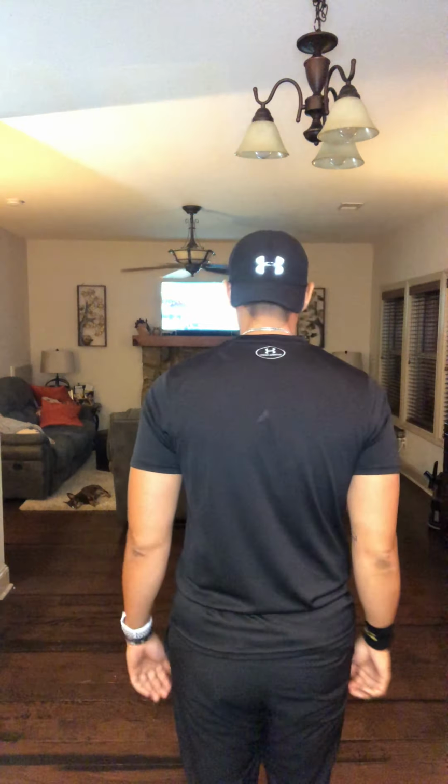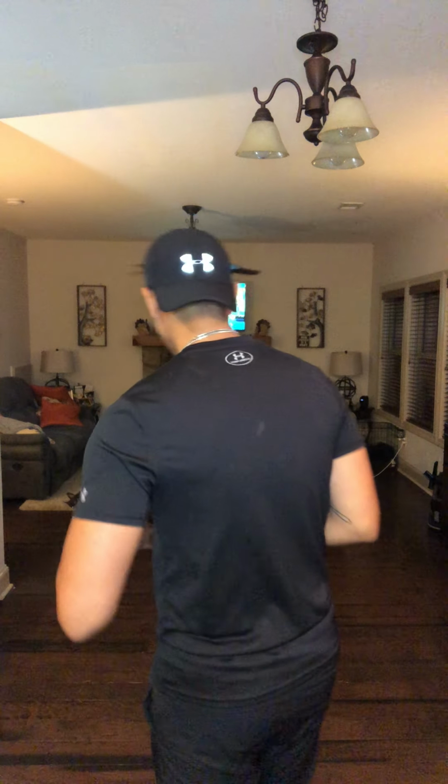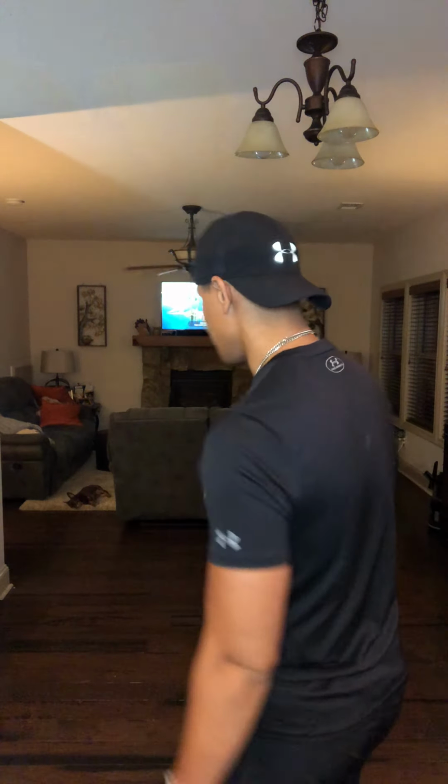Next projection is going to be the scapula Y projection. So in this case, the patient is actually going to turn and face the bucky. So I'm going to turn around, face the bucky. There's 60 degrees of rotation in this particular view. So body rotation. So have the patient facing the bucky. Again, we're going to use my left shoulder as the affected shoulder.